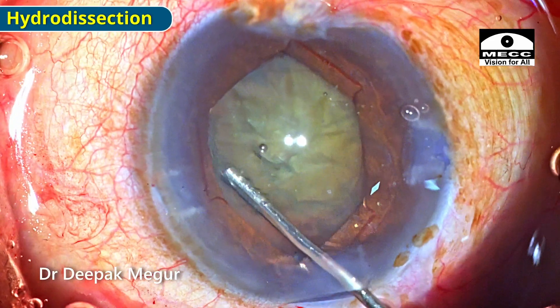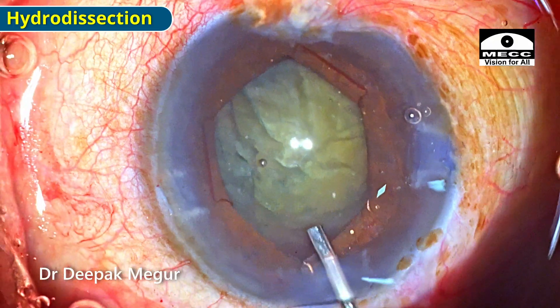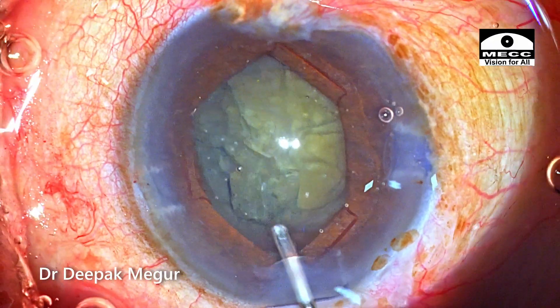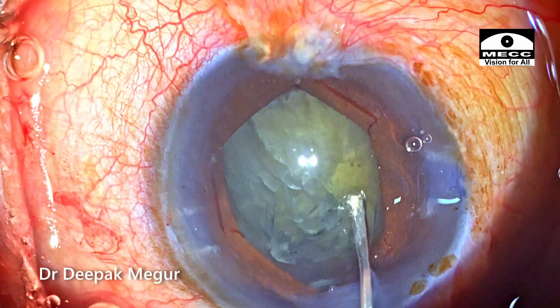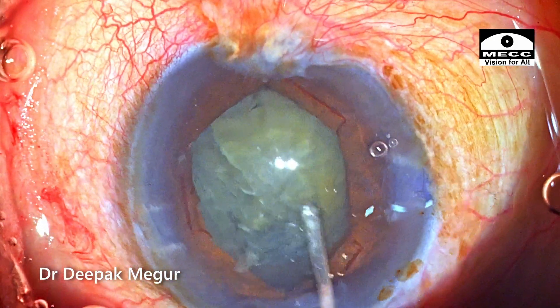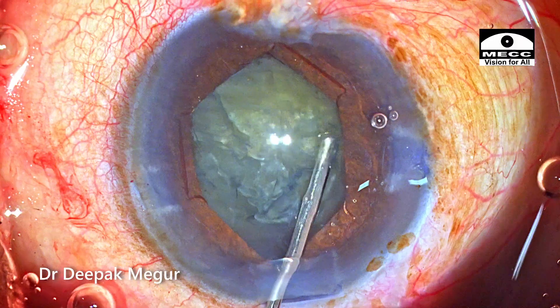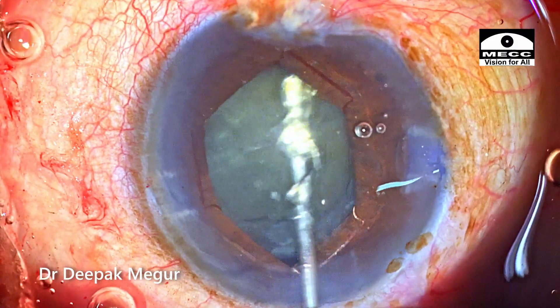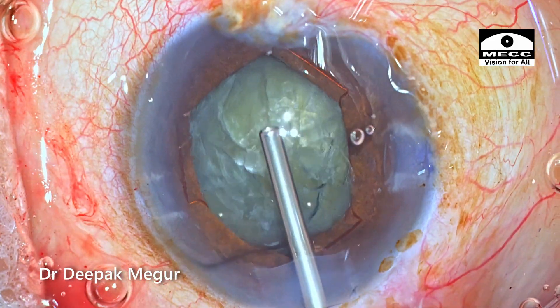Hydrodissection is probably one of the most important steps in such eyes with suspected weak zonules. I always like to spend a couple of minutes more just to ensure that all the cortico-capsular adhesions are broken. After the hydrodissection, I'm not still sure that the cortico-capsular adhesions are totally off, so it's repeated until I'm sure that the nucleus and lens matter are totally free from the capsule attachment, confirmed by nucleus rotation.